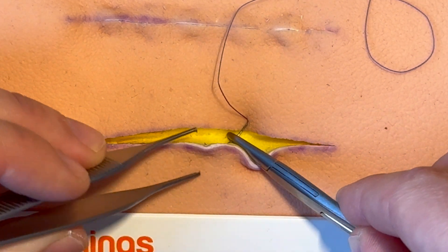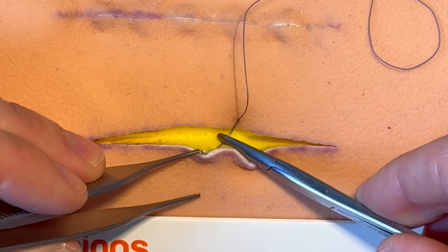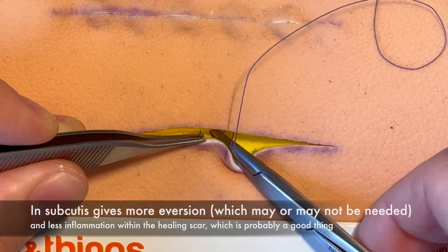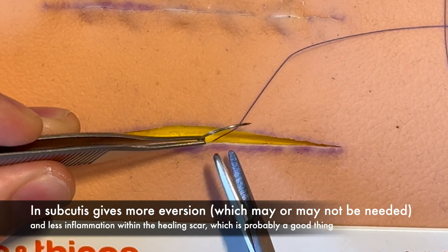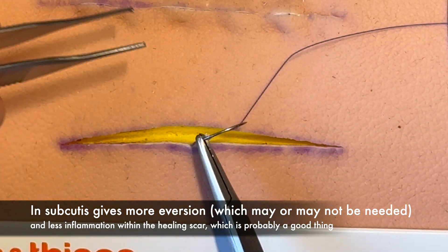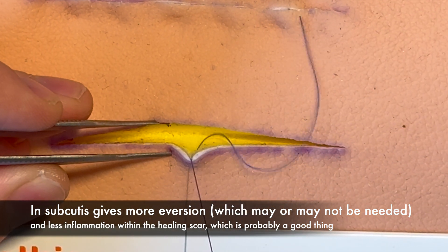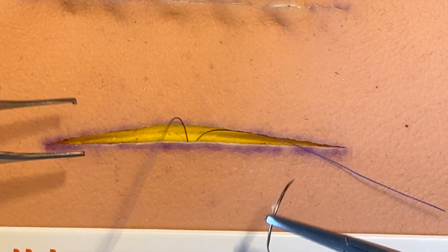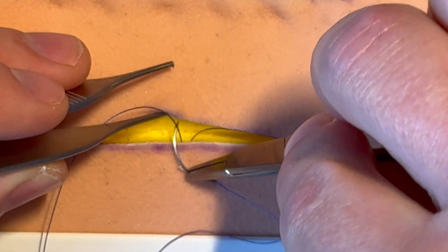You've caught the dermis, and then you come back under — either through the dermis or just in the subcutaneous fat. Grip it again with the skin hook or forceps, not gripping the sharp tip. Remount it, pull the thread through, and then place it in an identical position on the other side so you've got a match.